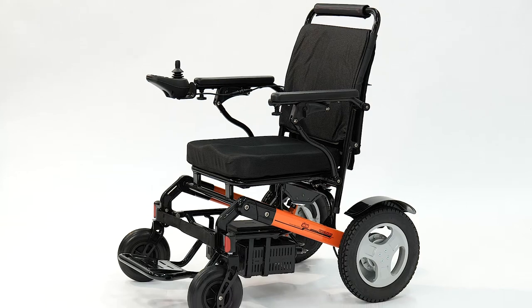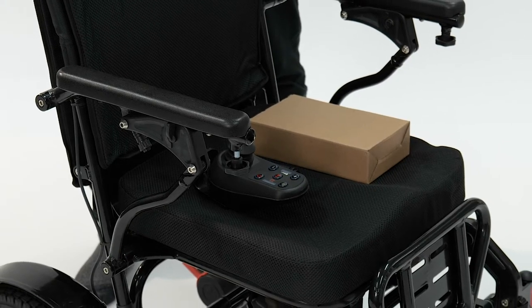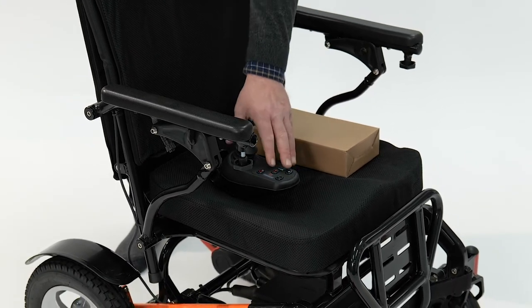Hi, I'm Chris from Monarch Mobility and today I'm going to introduce you to the Easyfold Powerchair. Your package will consist of the power chair, the charger and the control.